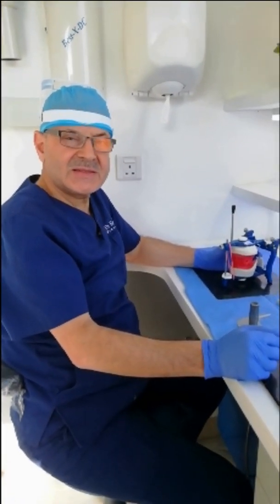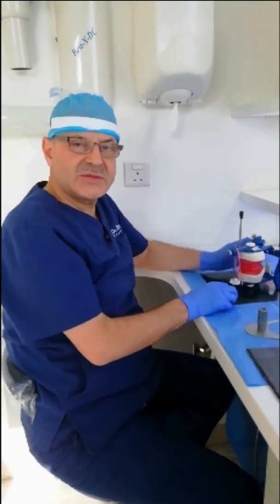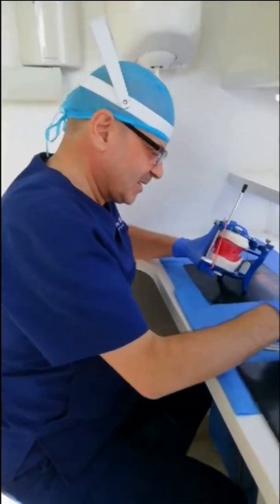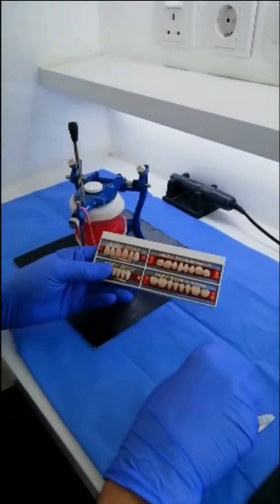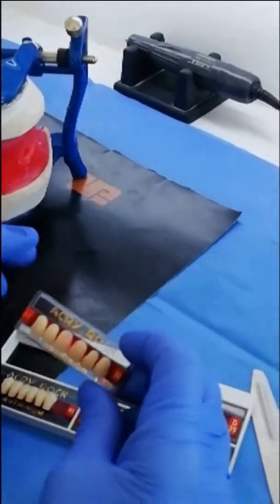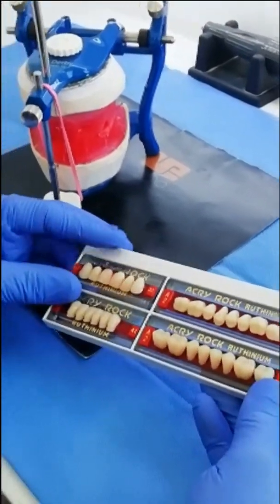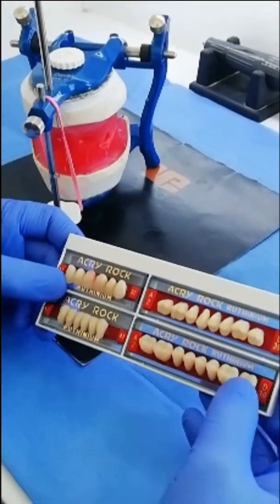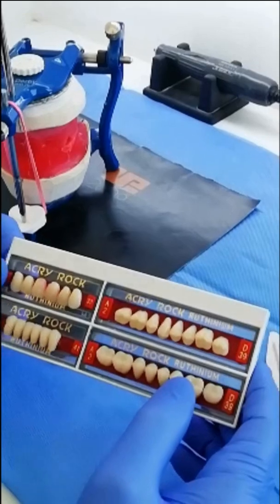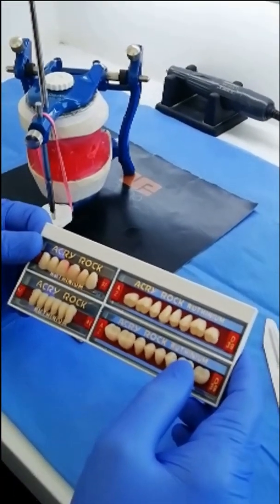Now let us start arranging the artificial teeth and let us have some fun. We have the set of selected teeth and we start the arrangement with the upper anteriors. The upper anteriors have aesthetic importance as they affect the patient's appearance.